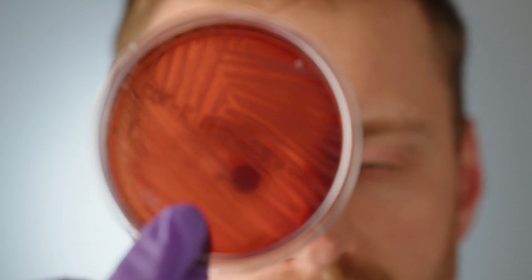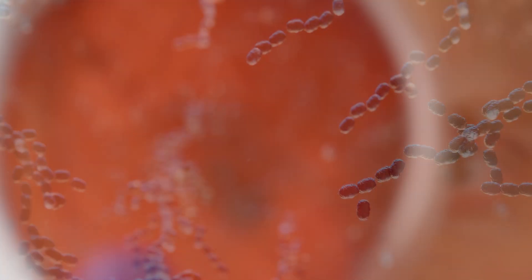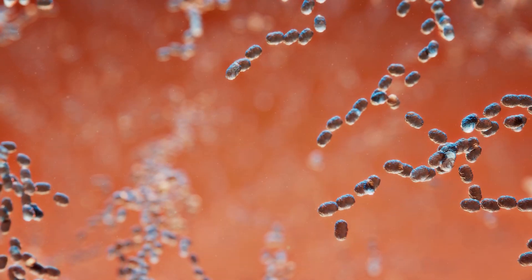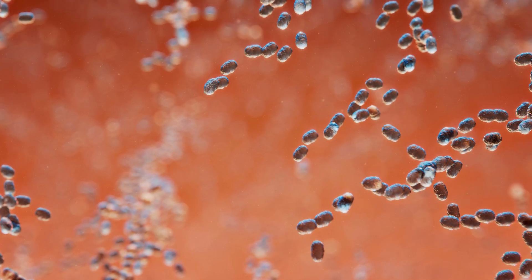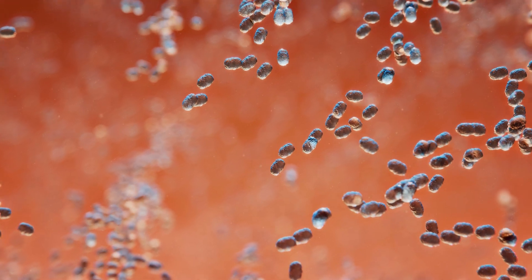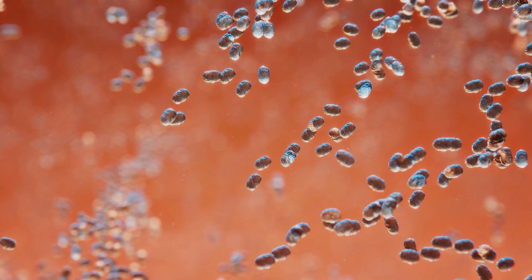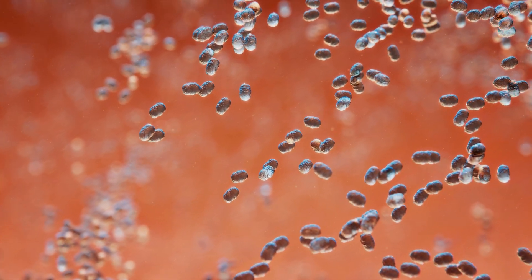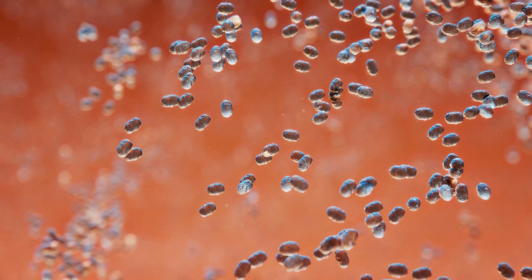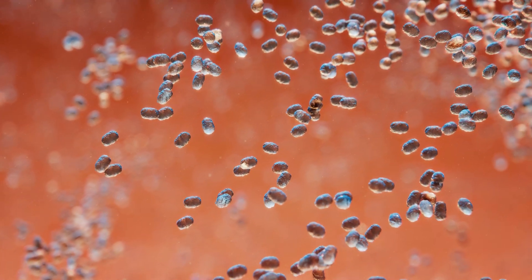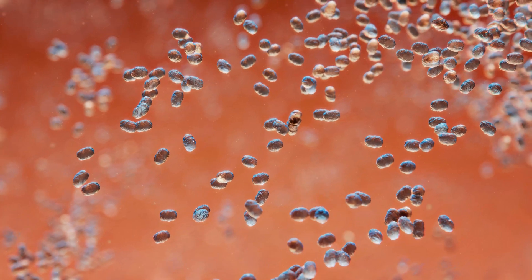In microbiology, we study the beauty of life in its tiniest form. Essential to all life on Earth, microorganisms are everywhere.